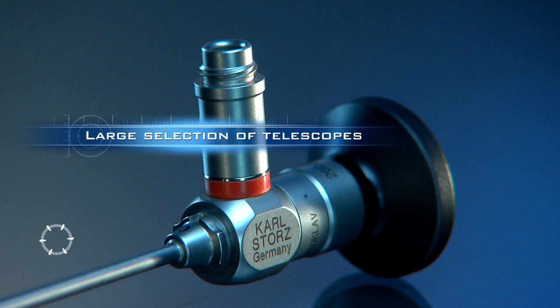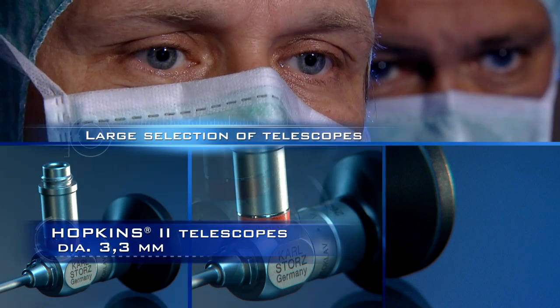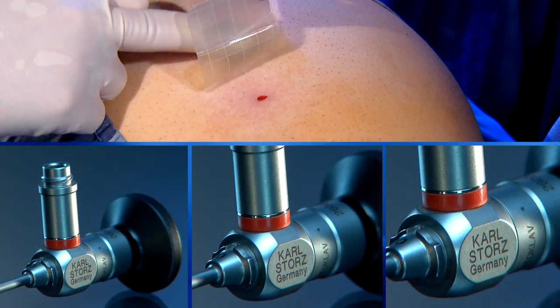The 3.3mm Hopkins II telescope complements the range of telescopes available and enables the surgeon to keep the ports as small as possible.